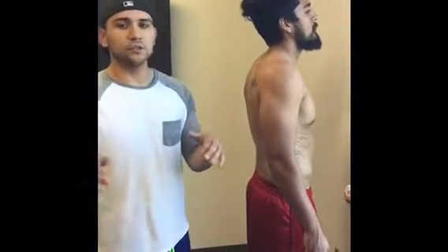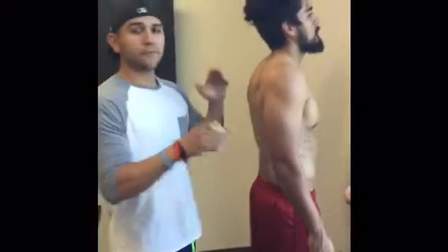You don't want to pinch above or below the mark, and you don't want to pinch the muscle or just the skin only. We're going to be placing the calipers 1 to 2 centimeters away from the thumb and index finger. Measure halfway point between the crest and the base, and you want to take each reading within 1 to 2 seconds. Each site, the 7 sites that we're going to be taking, are going to be assessed 3 different times. We're going to grab the mean of those, and then that will help us calculate and punch into the formulas.